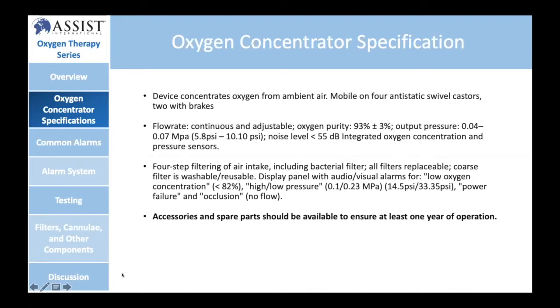So there should be some alarm for that, and also, as I said, high or low pressure alarm, and also power failure alarm, and so on. My friend Benjin and my colleague will go through all these alarms that you need to know as a clinician.